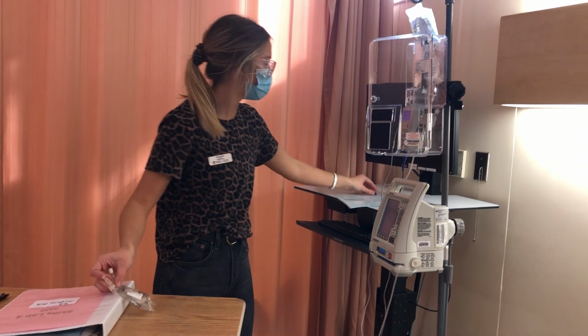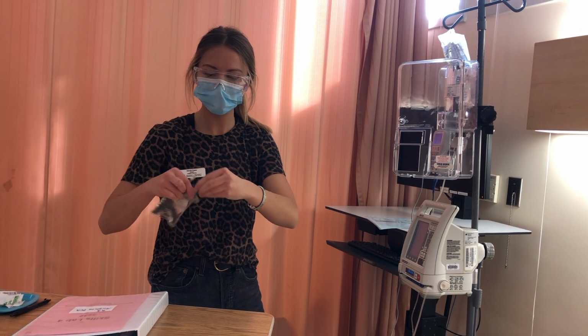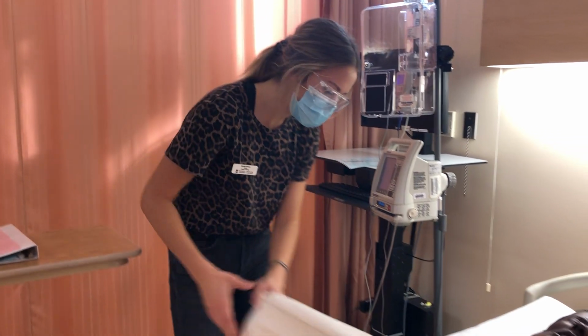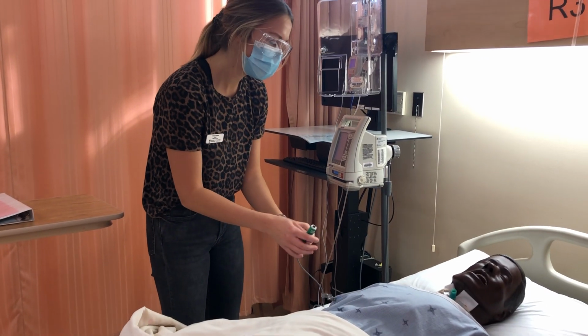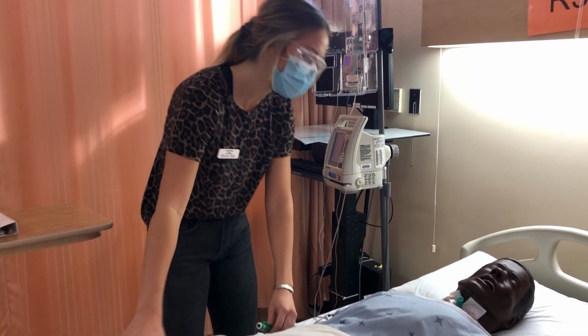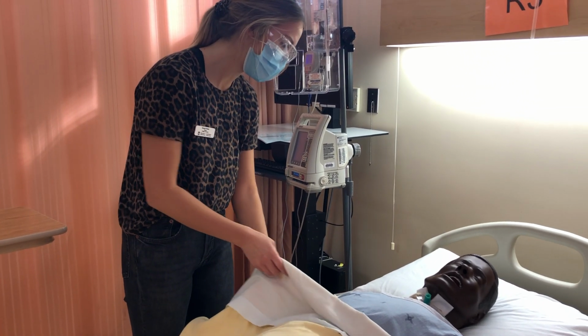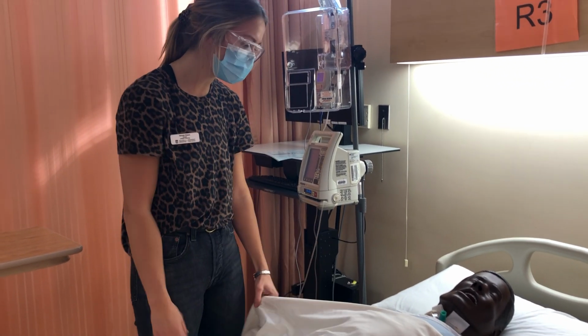I would also put this away and make sure the patient's comfortable. So here is your PCA button as well as your call bell in reach. So if you do feel like you're in pain, just hit this button. Make sure that only you hit the button, not your family members at all.